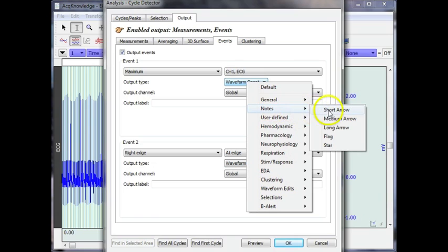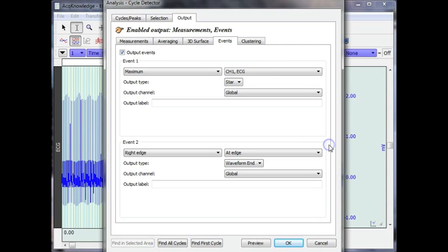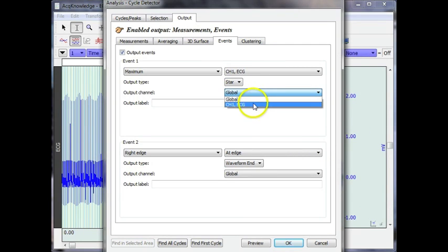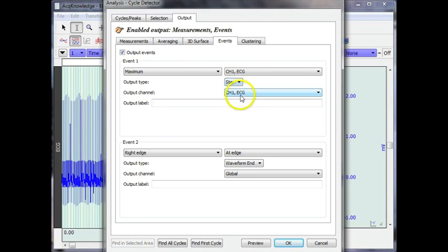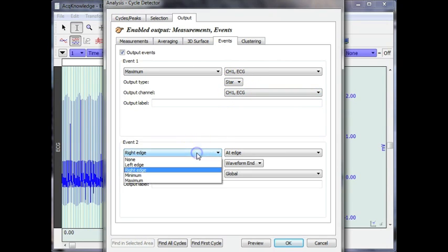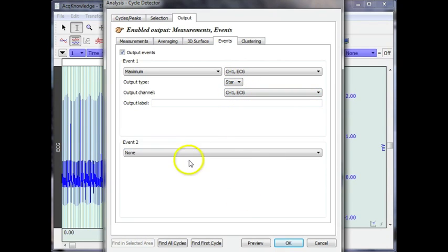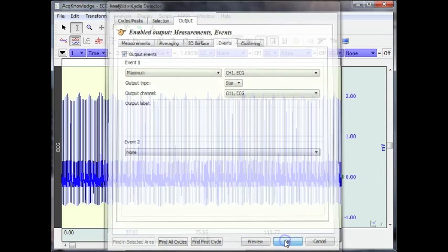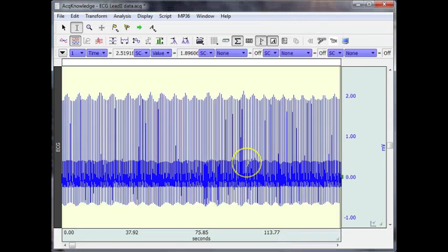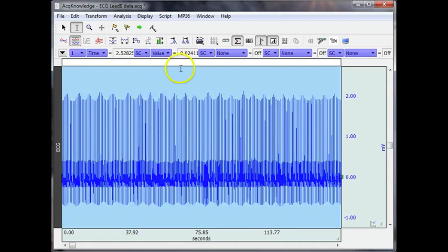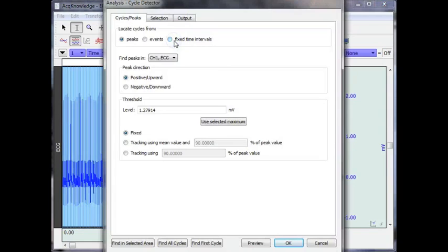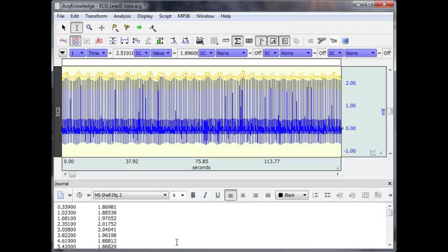And we are going to use a star and we're going to paste the star on the top of the waveform. I'm going to turn this one off, I only need one event. And select all. So I've selected all my data, come back in and say find all cycles.